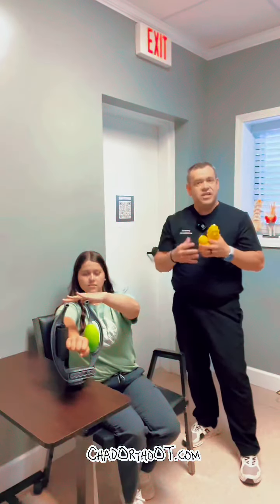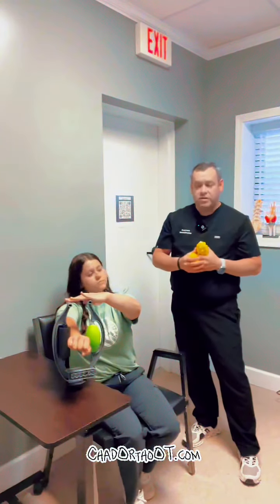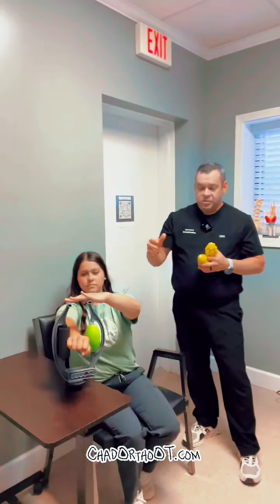So what you can do — this is adjustable. It comes with three different pieces: the green piece and the two yellow pieces. They kind of change the intensity of the rolling that you get.